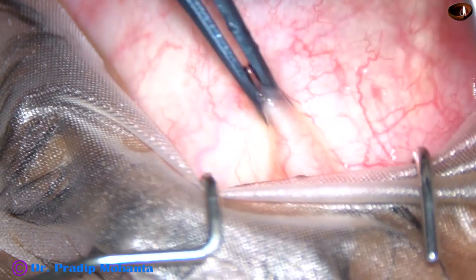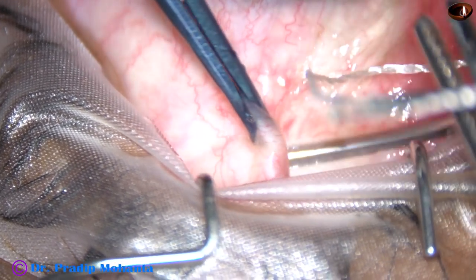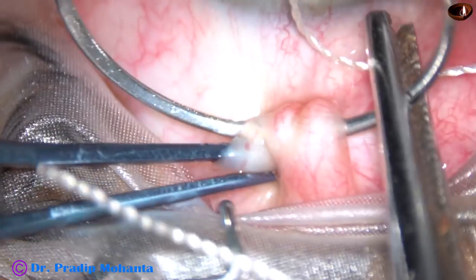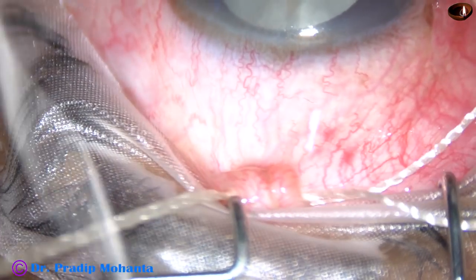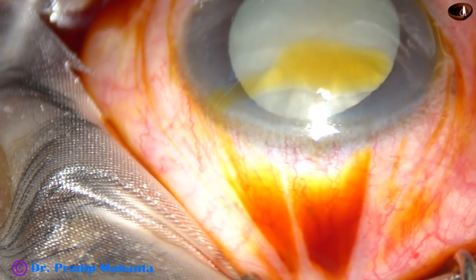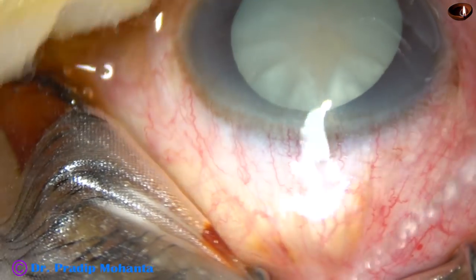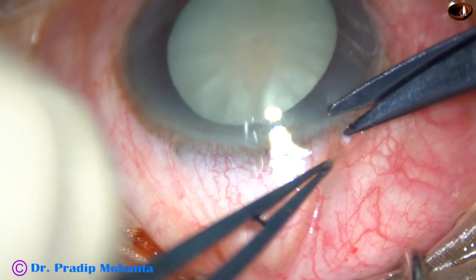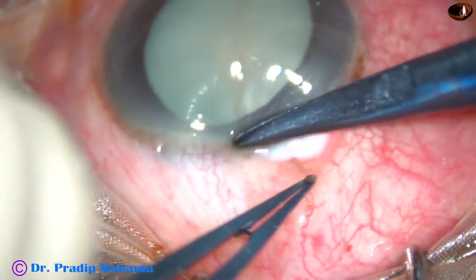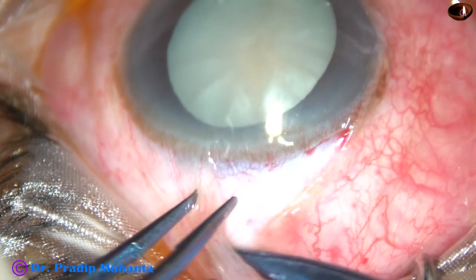This is a manual cataract surgery for ophthalmology residents, called SICS — Small Incision Cataract Surgery. This is how the superior rectus bridal suture is placed. The incision size is 7.5 mm, which is the ideal measurement for the beginner. The nucleus comes out completely most of the time if the incision size is 7 to 7.5 mm.